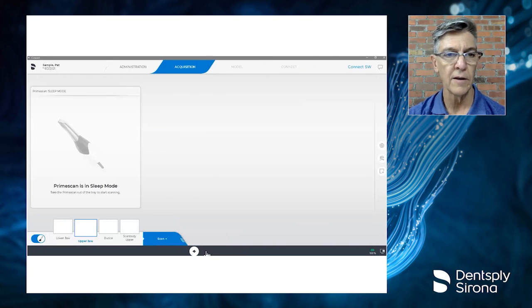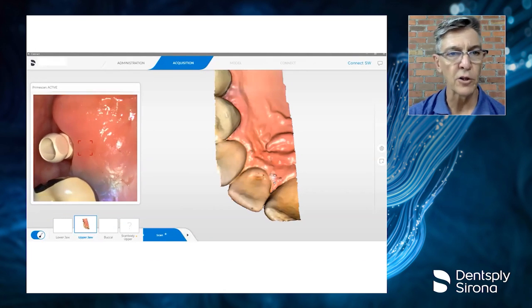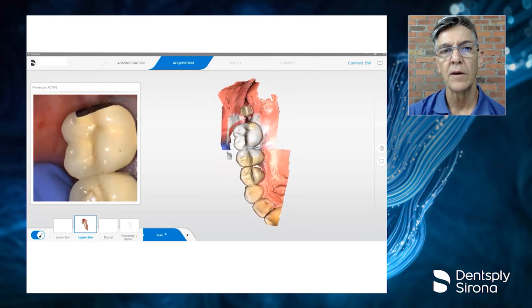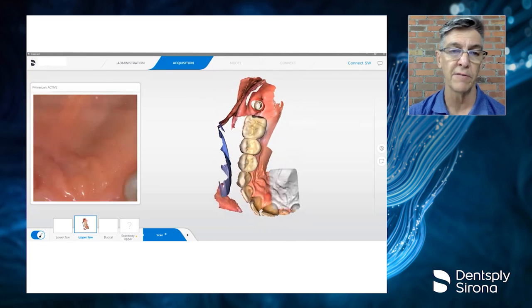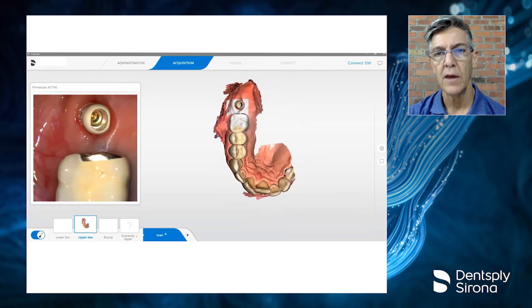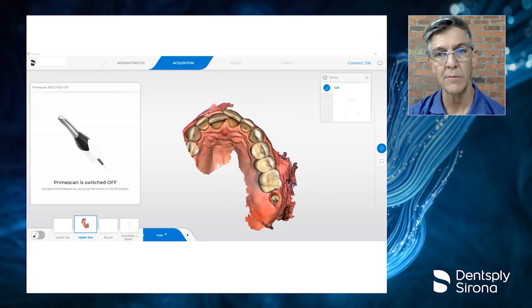So once done, we are ready to scan. So I'm going to show a quick little demonstration of scanning. I know most people have done this. Importantly, I want to scan the scan body architecture. So I want to get that flat surface on this one, as an IO flow. It has a flat surface. And of course, I'm going to scan the rest of it as necessary and make sure that I've got a very nice reproduction of the scan body.